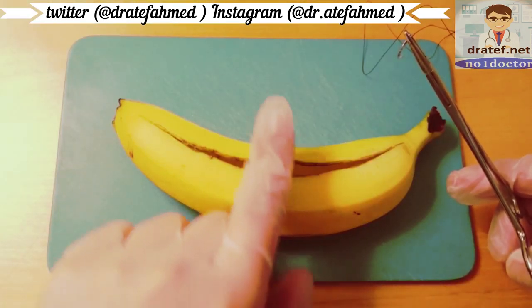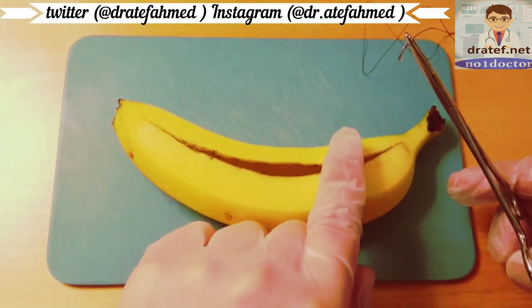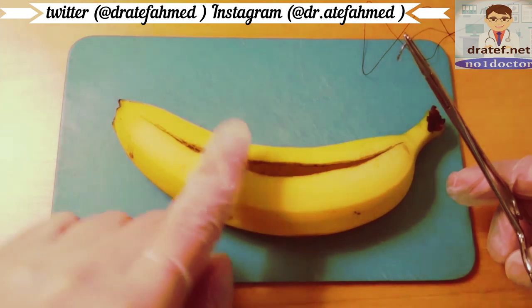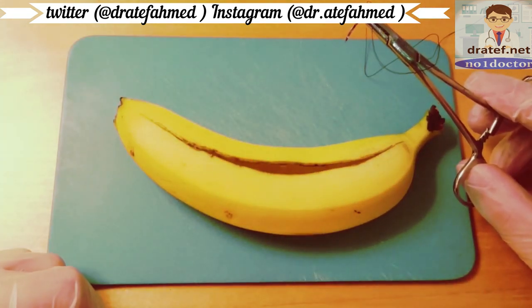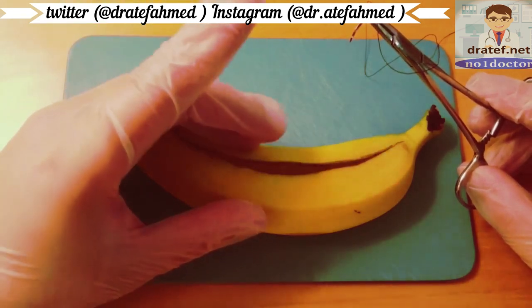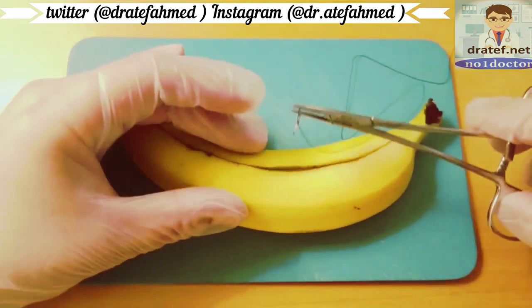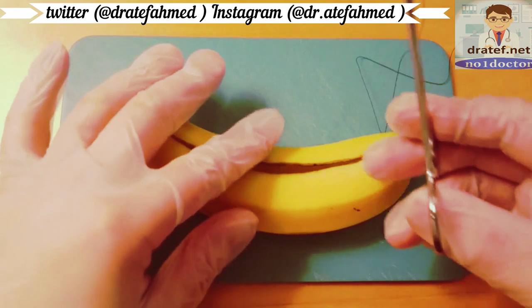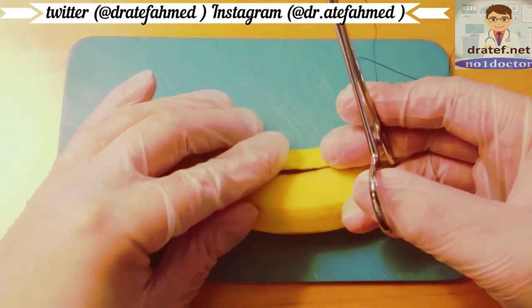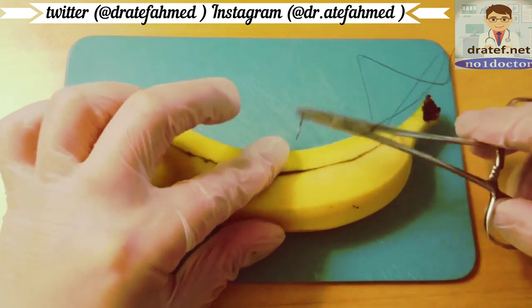When suturing, you always start at the middle of the wound, then halve, halve, halve, halve. A tip while suturing is to always keep contact with the patient — for example, keep a finger down on the patient. Start by placing the wound in a good position and begin in the middle.